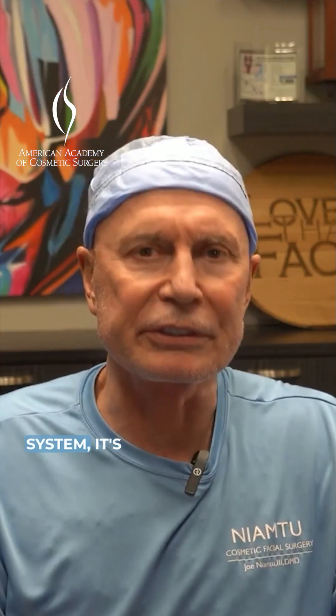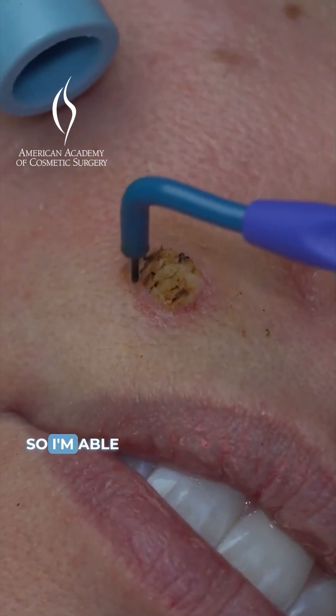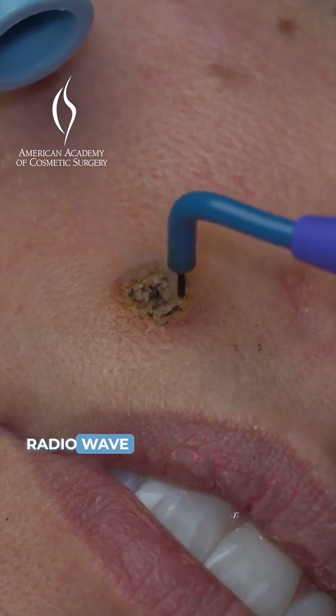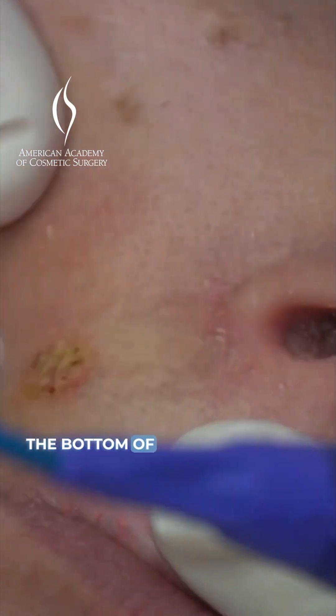The radio wave system is just a more gentle removal system. I'm able to take that radio wave instrument and just melt away layers at a time until I get to the bottom of the mole.